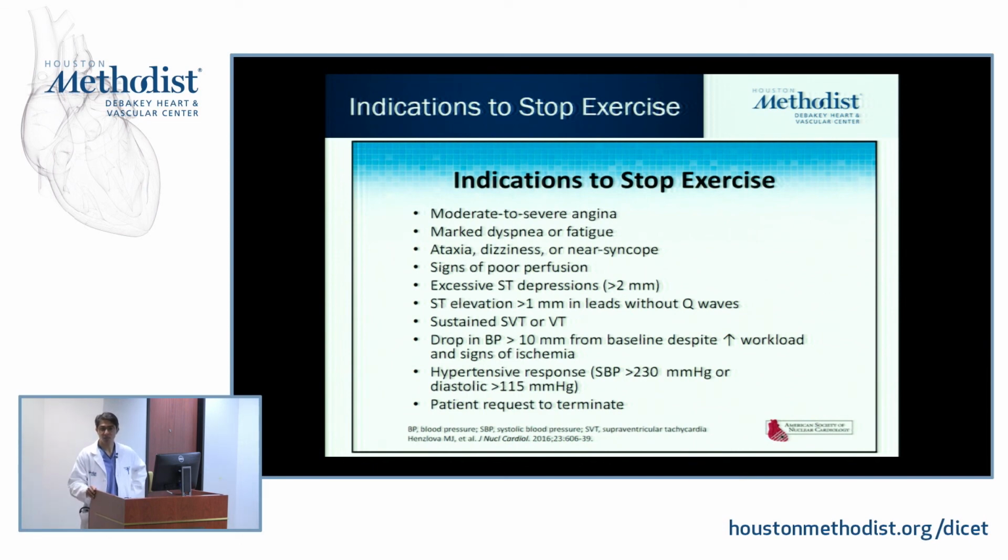With exercise, again, blood pressure should always increase. If you see a drop in your blood pressure, that can be an ominous sign. Now, just be careful, there's a caveat to that. A lot of times, remember, these patients are running, so there's a problem with correct detection of blood pressure. Either you do it manually yourself, or just recheck the blood pressure. If the patient looks completely fine and you're noticing the blood pressure is low, it could just be that the machine is not detecting it correctly. And then again, if you see marked hypertension, we don't want anybody to have a stroke or anything like that.